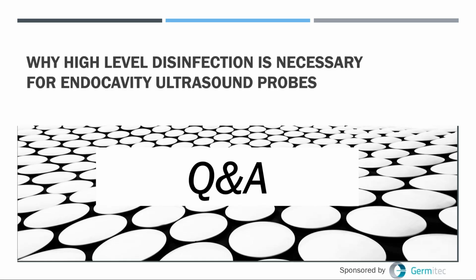HPV is very difficult to culture. So the most common way of testing is to actually look for HPV DNA, which can be done. And certainly if there's no DNA on the device after cleaning and disinfection, then you have eliminated all the HPV. However, if you do find HPV DNA, it doesn't necessarily mean it's viable HPV, in which case you would have to use a culture technique to find the HPV, which is difficult, but there have been published techniques there.